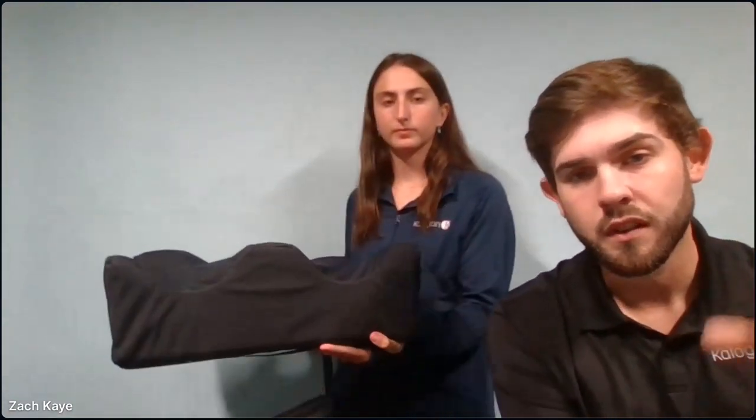The cushion is going to be sensing how someone is sitting, and it completes timed pressure reliefs every 2, 3, or 5 minutes in those air cells along the back. So the front 2 thighs will always remain at the same set pressure to help with posture. And then the 4 air cells along the back will complete pressure reliefs every 2, 3, or 5 minutes. If you have the 2-minute mode, it'll go down from the set pressure to 0 at 2 minutes, and then raise back up to your set pressure.